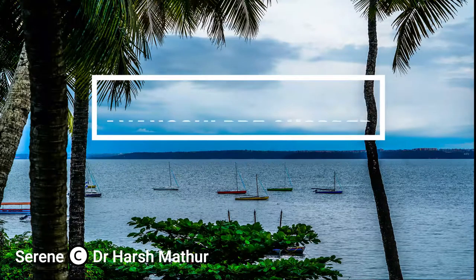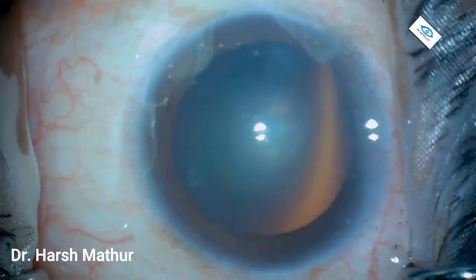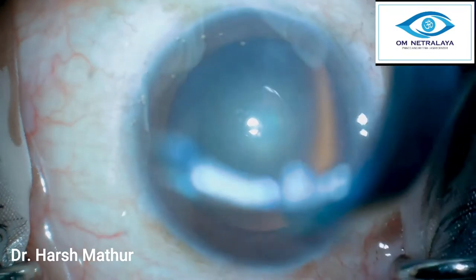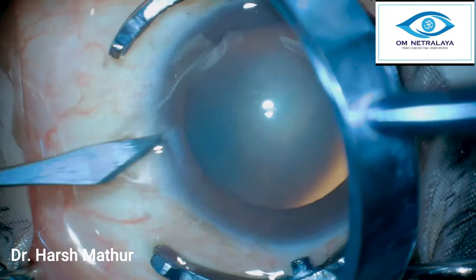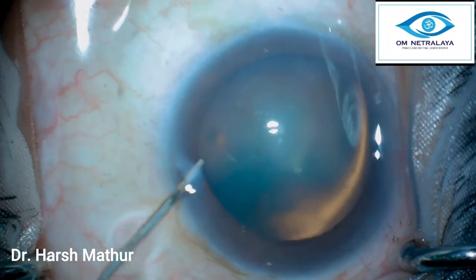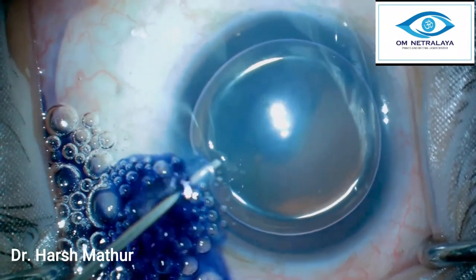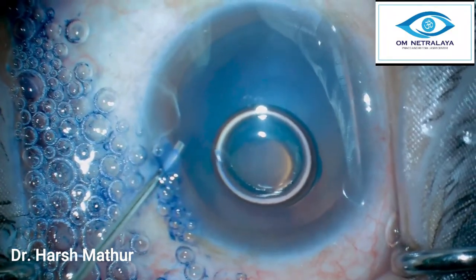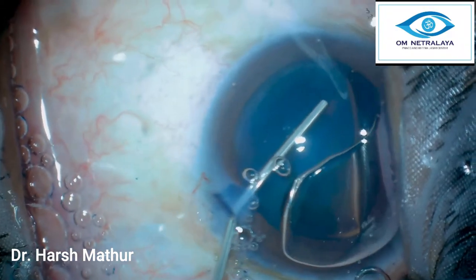Today we will be discussing how to use the Akahoshi pre-chopper and how it has made dealing with soft cataracts so easy. This is a grade 1 to 2 nuclei, and there are various ways to tackle these soft nuclei — the old traditional ways such as direct chop, stop and chop, divide and conquer, tilt and tumble, and supracapsular phaco. These pre-choppers have really redefined the ease with which we can tackle soft nuclei.